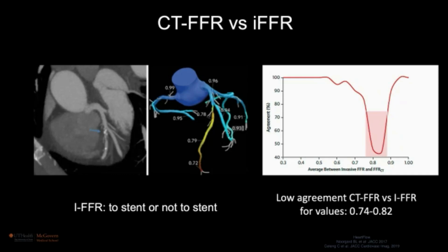There's a whole lot of data to show that CT-FFR is very well correlated with the anatomical appearance of the lesion, like in this case, a complex plaque in the LAD, which leads to decreased FFR below 0.8 in the CT-FFR evaluation.